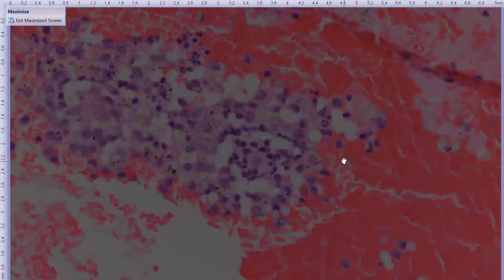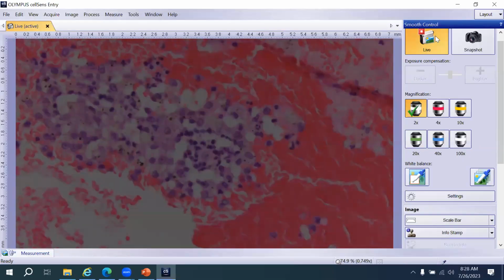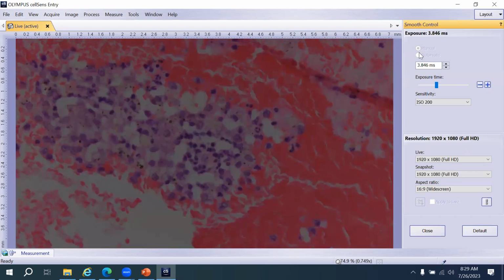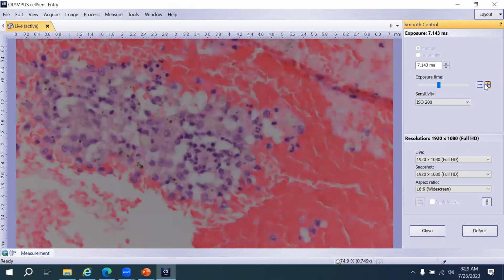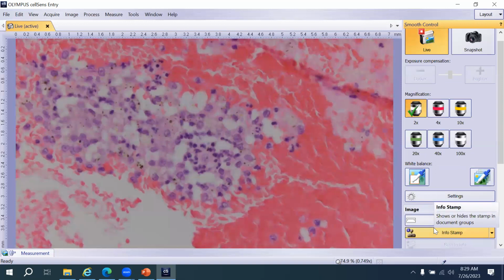Indeed, we sometimes see, nope, it's just dark this time. These little organisms here. Let me see if I can fiddle with it some more. I need an automatic setting. Oops. It's not giving you the option to do that. It's because I started in simple mode. Oh, I see. Somebody suggested white balance, which you can do, but then it doesn't seem to stick. I don't know.